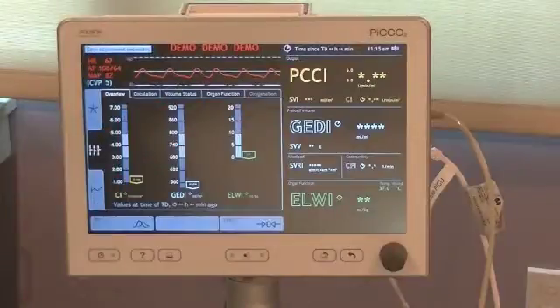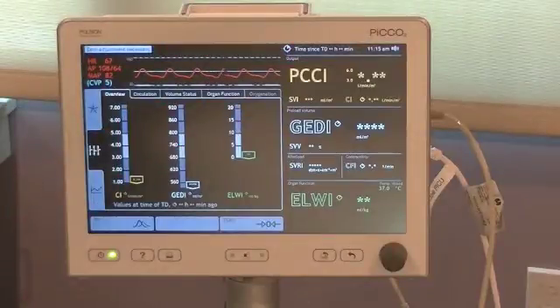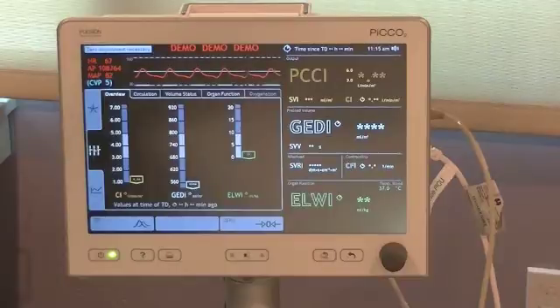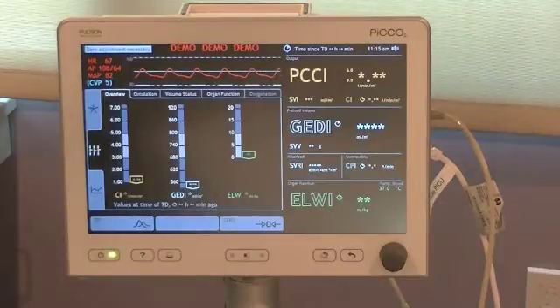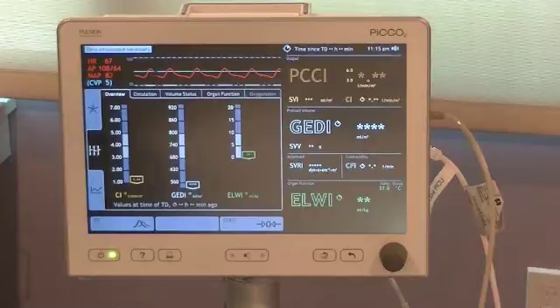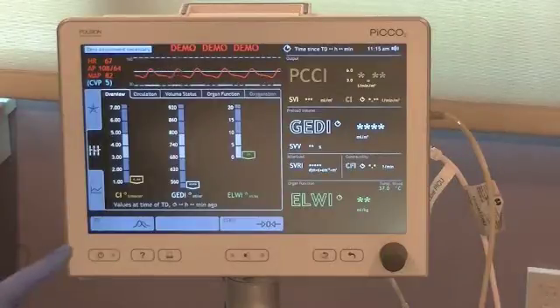This video will show the thermodilution process using the PICO2 monitor. Watch the previous videos regarding setting up and programming of the PICO2 monitor.